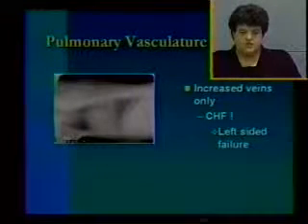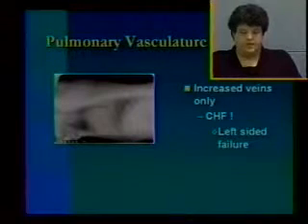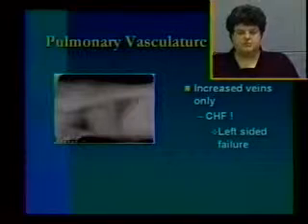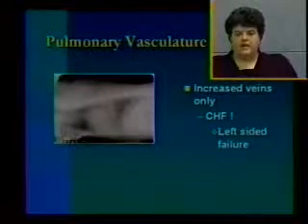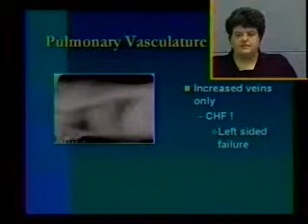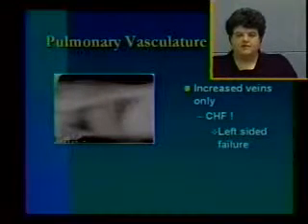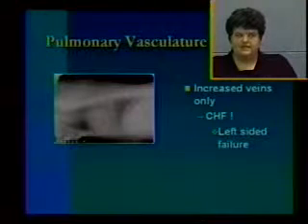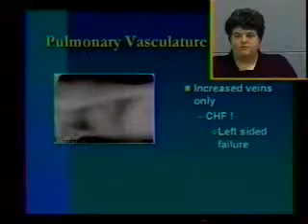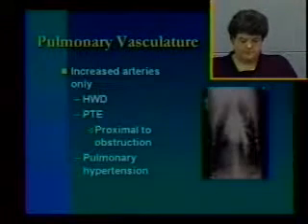He has a large left atrium and straightening of the cardiac silhouette. He also has increased opacity in his perihilar region, which is the typical place, unlike the cat that we just saw, where dogs get pulmonary edema. That's the first place that the pulmonary vein pressure becomes so high, and it's the first place they leak. It's right near the hilus of the heart. In the cat that we saw, you saw that it had a more patchy, uneven distribution.